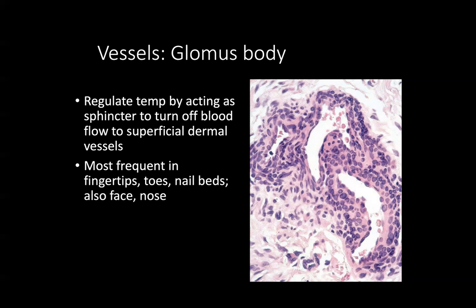You can have a glomus tumor that can develop under the nail, but you can also have glomangiomas, which is kind of a combination of a hemangioma and a glomus tumor. So what happens is you have these small glomus cells that proliferate and develop these large lumens of vessels, and it almost looks like a hemangioma, but it has all these monotonous cells around it. And that's a glomangioma. It's just a combination of the words glomus tumor and hemangioma together. It's an important entity you'll need to be able to recognize, and we'll show you examples of that in later lectures as well.